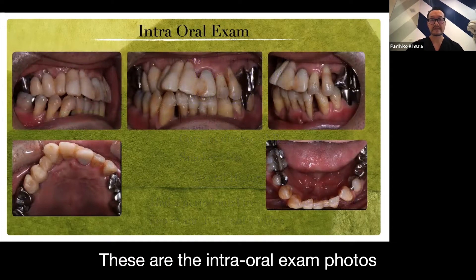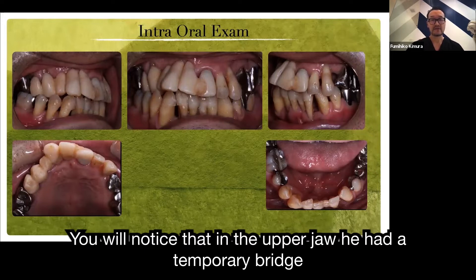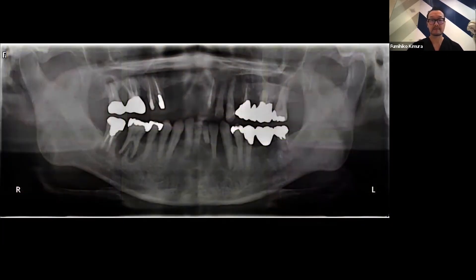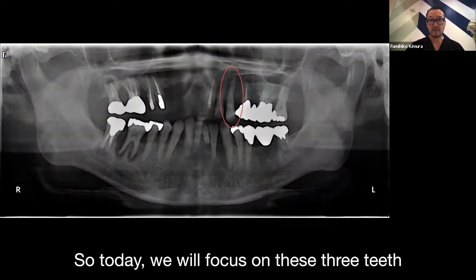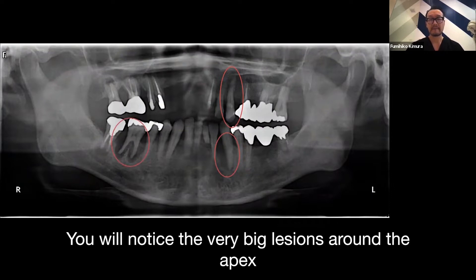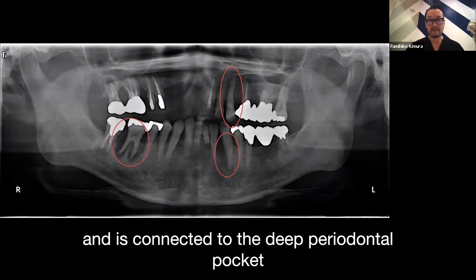This is the intraoral exam photos. You will notice that on the upper jaw he has a temporary bridge, and on the lower jaw he had a temporary fix with composite. This is the panoramic x-ray. Today we focus on these three teeth. You notice the very big region around the apex, and it is connecting to the deep periodontal pocket.